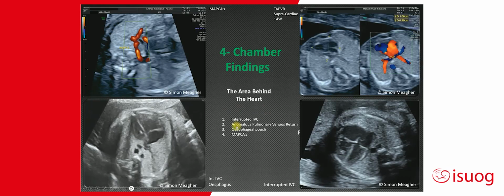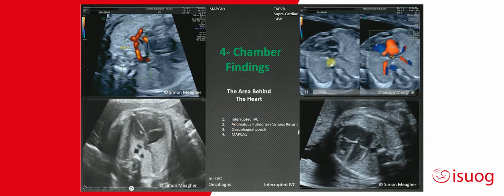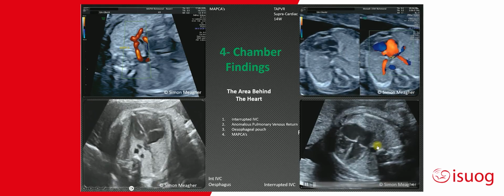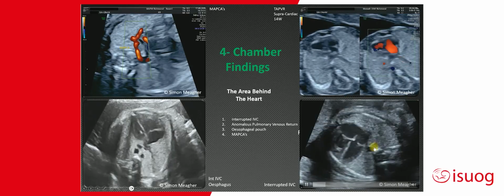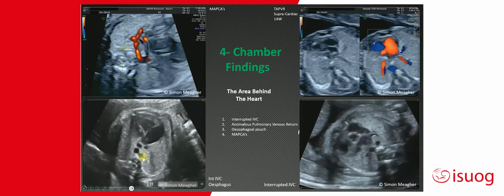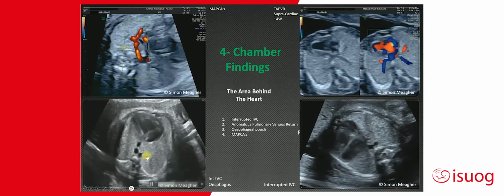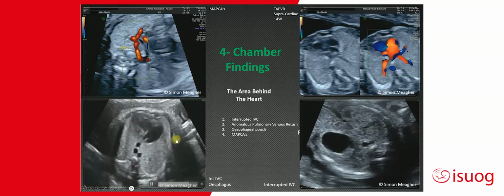And lastly, looking behind the heart, you may pick up the common venous channel of total anomalous pulmonary venous return, which I mentioned earlier. You may pick up two vessels behind the left atrium in the setting of an interrupted IVC with azygous continuation. Sometimes you may see three vessels behind the heart with the interrupted IVC with azygous continuation, and the third vessel will actually be the esophagus. It'll be transient and disappear with time.